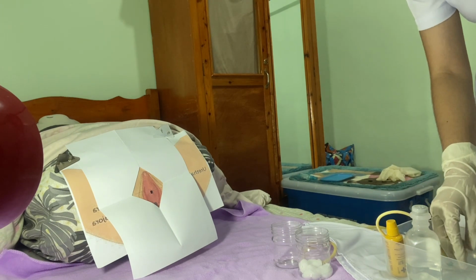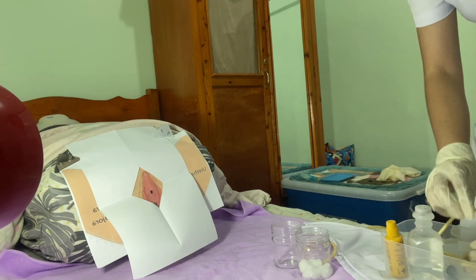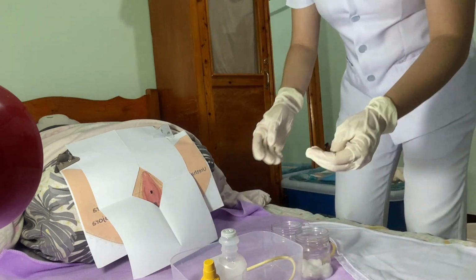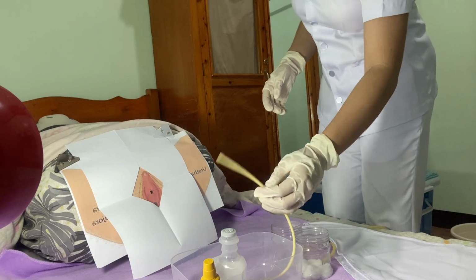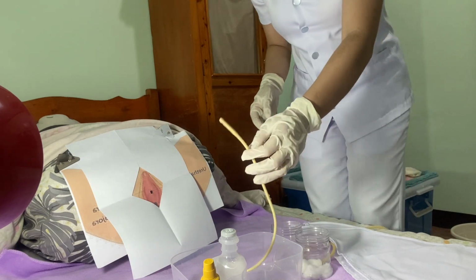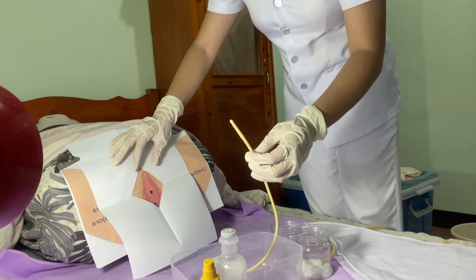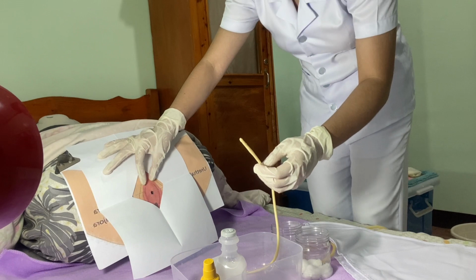Okay, so now I'm gonna place my tray here, and I'm gonna pick up the urinary catheter at least 3 inches from the tip, with my one hand placed on the labia minora of the patient, separating it, and pull up gently.